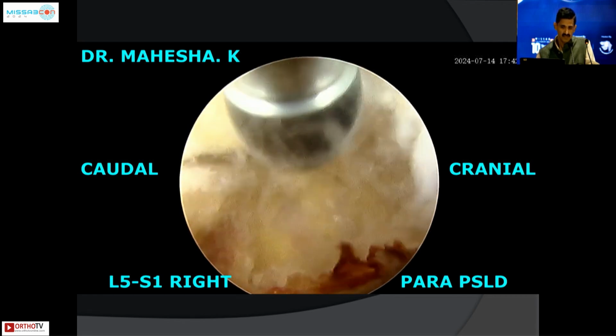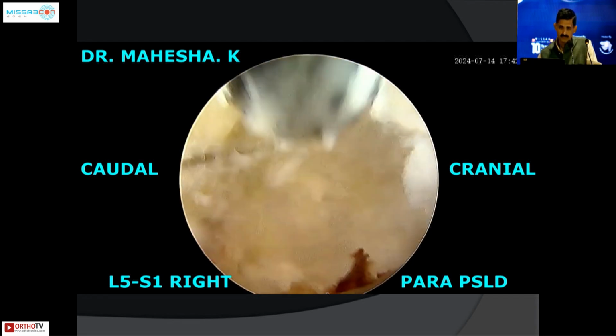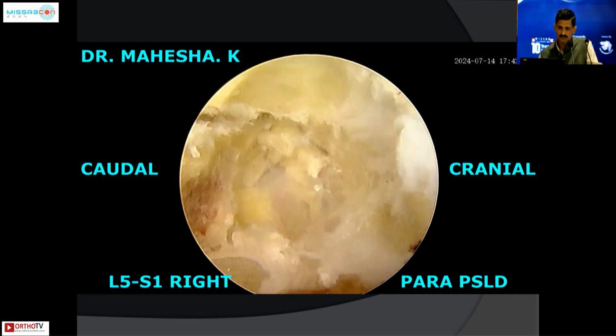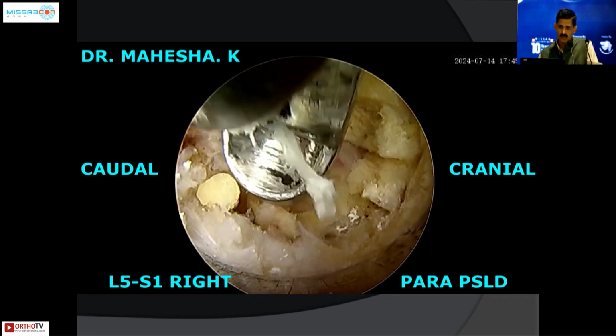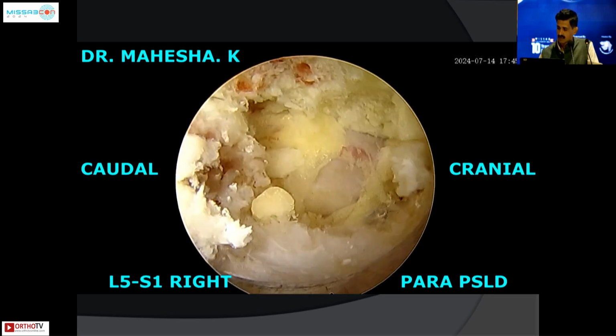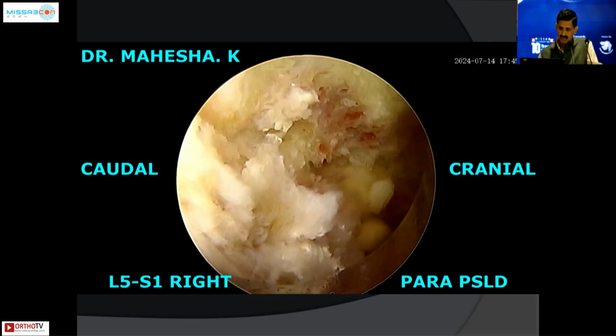So you can see the root at the bottom. Once the root is identified, it becomes easy. You can see the root and you can fully decompress it.